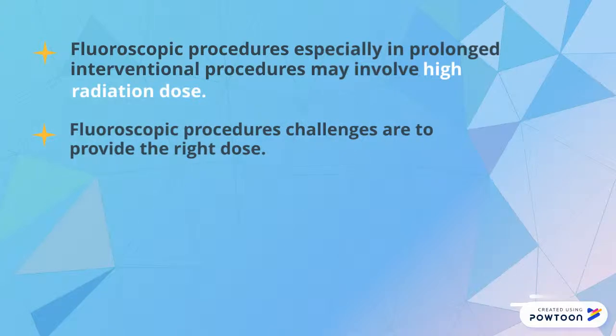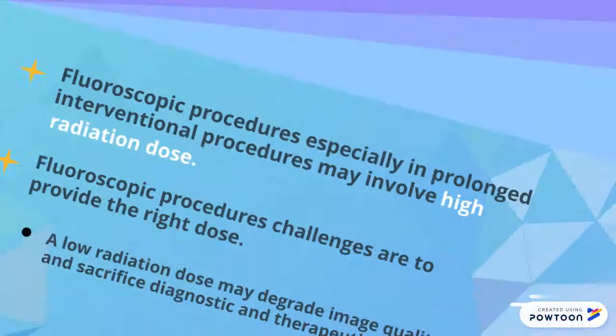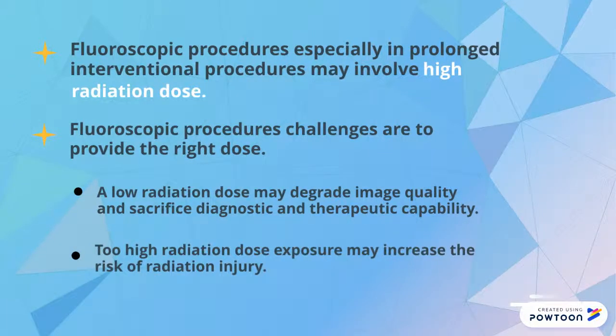The challenge in fluoroscopic procedures is to provide the right dose. A low radiation dose may degrade image quality and sacrifice diagnostic and therapeutic capability. Too high a radiation dose exposure may increase the risk of radiation injury.